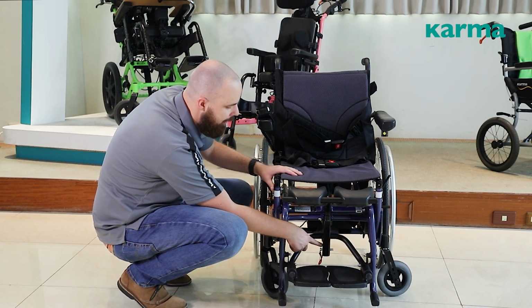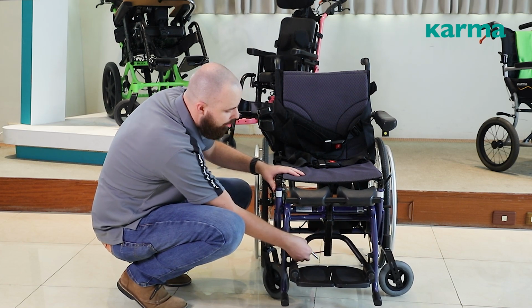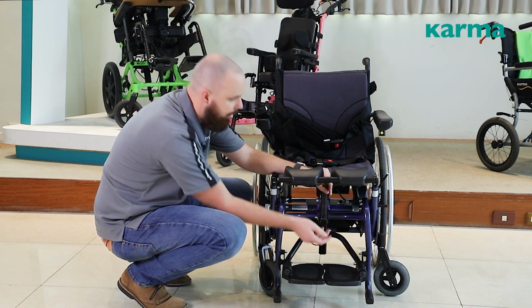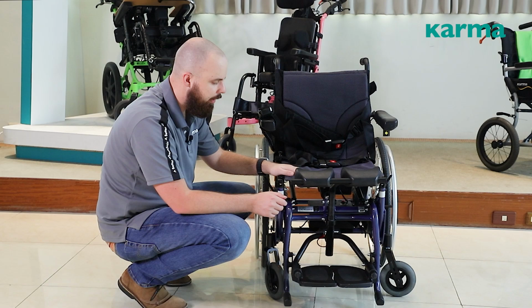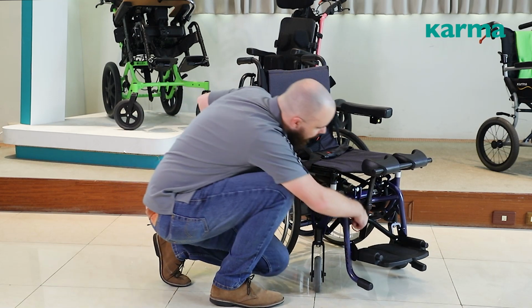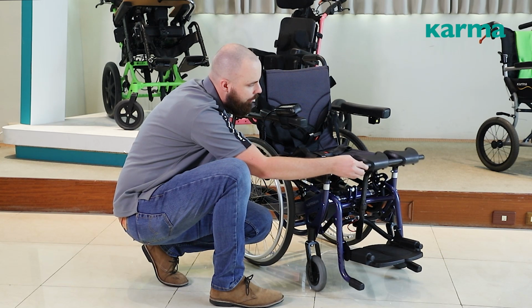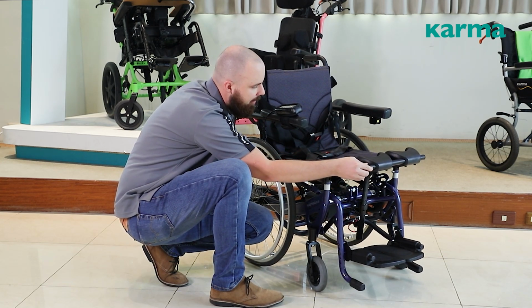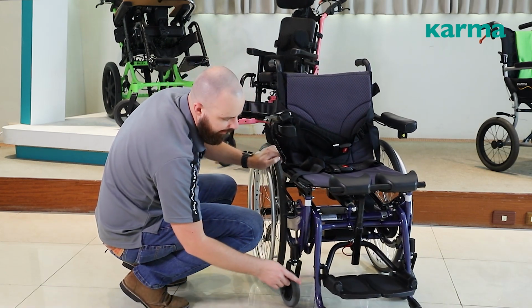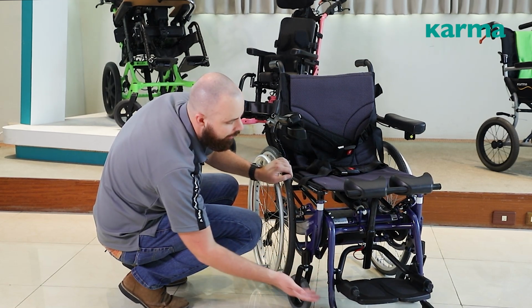And then we also have the height of the pads. There are 5 positions here. You can adjust that just by moving this quick release pin. Very simple. And then you can put it further up. So it was at the bottom before. This is the top level. And then the third adjustment we have is the angle. I'm not sure if you can see it, but there's actually a knob in here, and if you turn that clockwise or counterclockwise, you'll increase or decrease the angle that this comes at the knee. And then for the footrest, we have 4 different levels. So it's at the top now. We can move this 3 more positions down or anywhere in between if we need to.